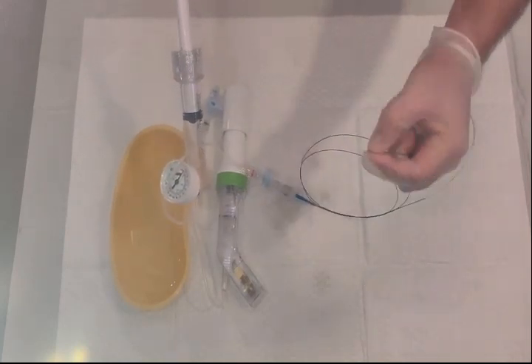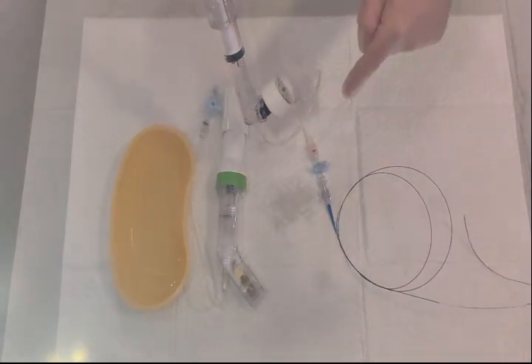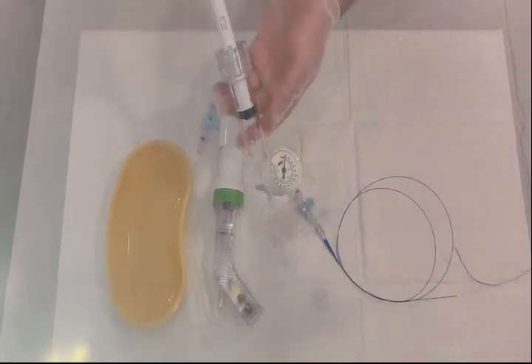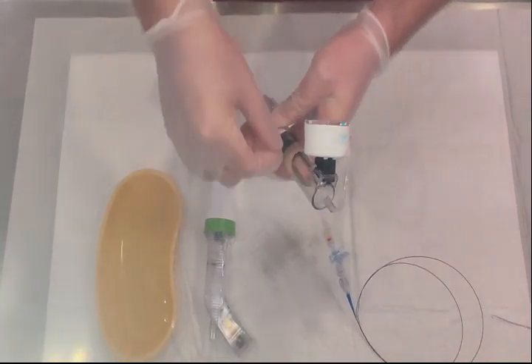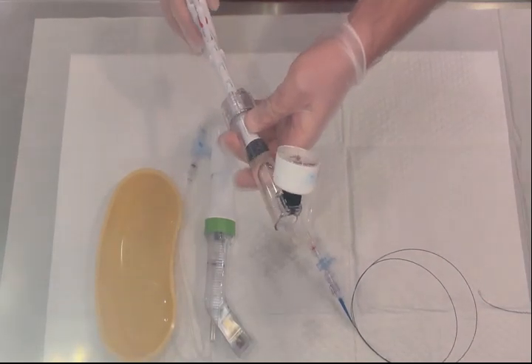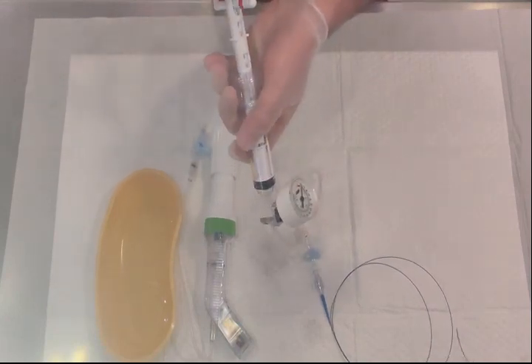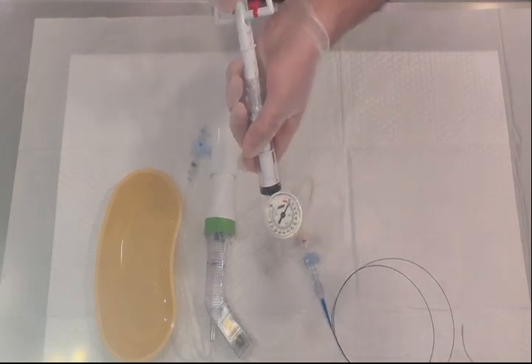The balloon is now deflated. Note that inflating with the device in the wrong orientation is incorrect technique, as it will draw potential air back in and you won't be able to visualize the contrast under fluoroscopy. The correct technique is to keep the inflation device oriented properly — unlock it and go clockwise on the meter to begin inflating.